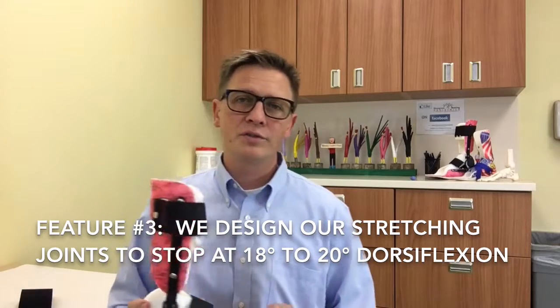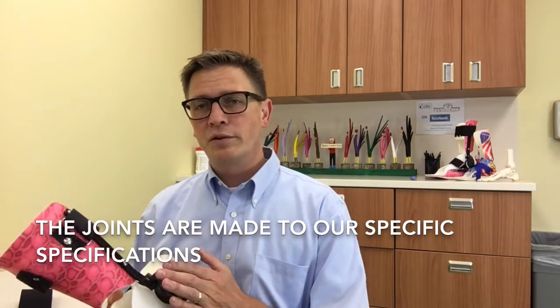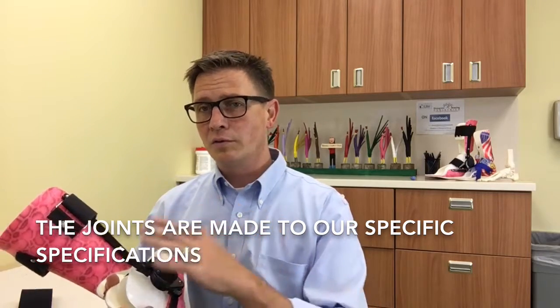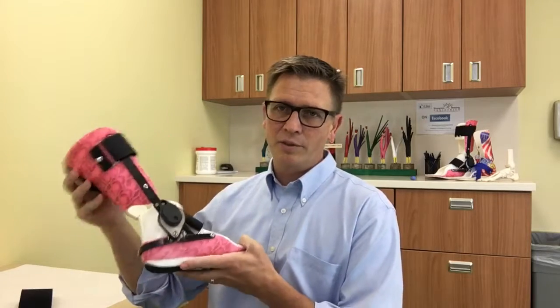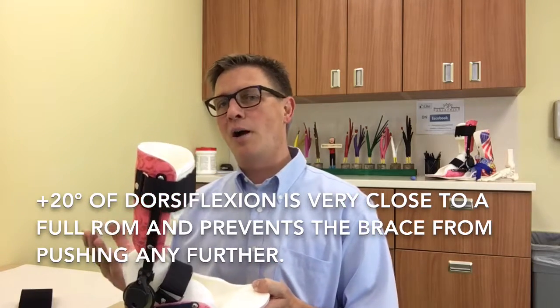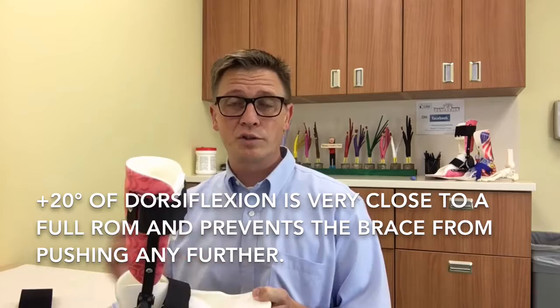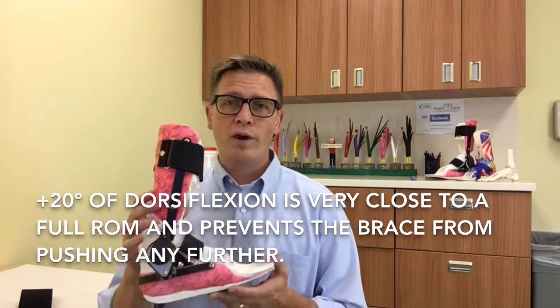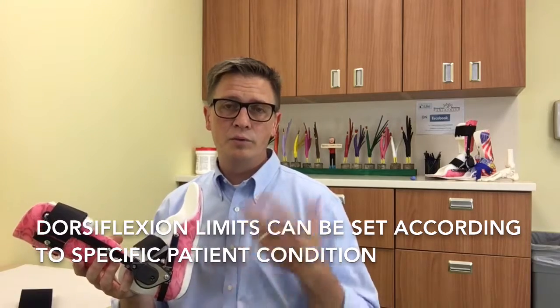The third thing that's important is to have a dorsiflexion limit on the orthosis. This is an example of an UltraFlex joint, which we use on larger kids — it functions very similarly to other components we use on smaller kids, about age eight or nine and younger, where we use a smaller, lighter component. This joint has a dynamic stretching component, and there's a dorsiflexion limit which we set typically at about 20 degrees of dorsiflexion to make sure we're not over-stretching the patient's muscle or compromising foot structure. We're very happy if we can achieve 20 degrees of dorsiflexion with a brace and hold that position, as that's going to do wonders for improving and maintaining range of motion long term as children grow.